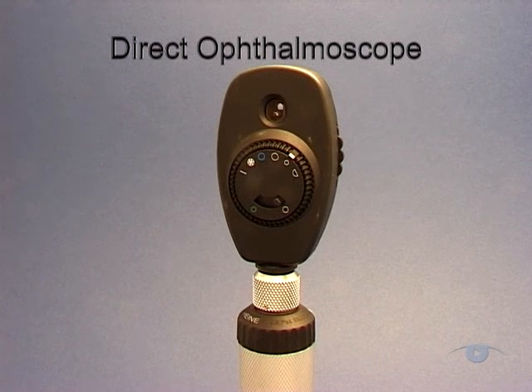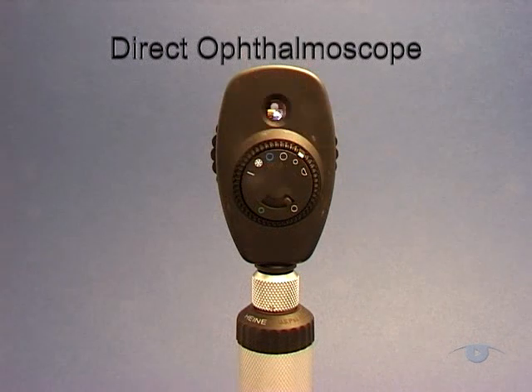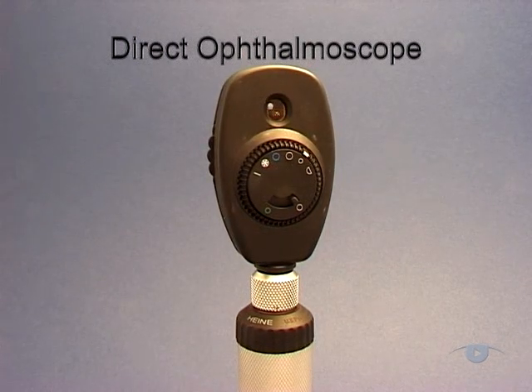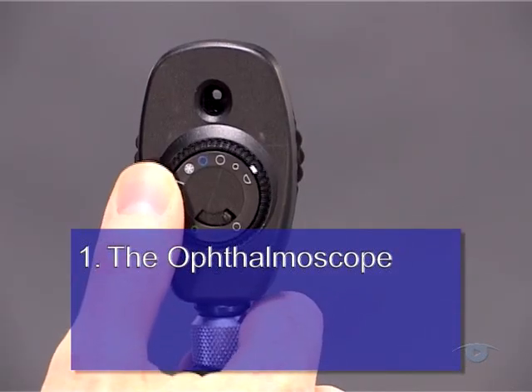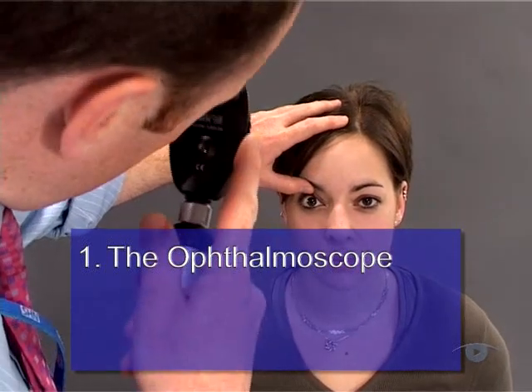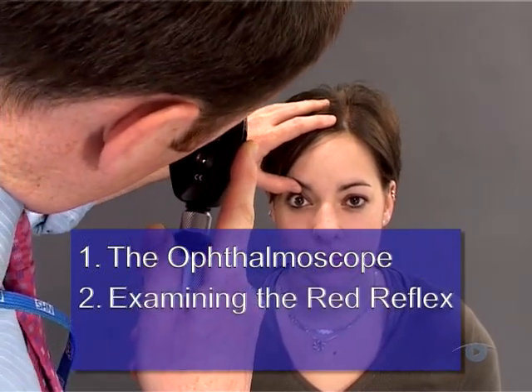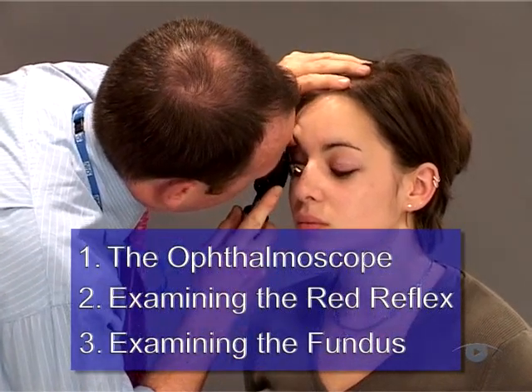The principal aim of this video is to teach you how to perform ophthalmoscopy using the direct ophthalmoscope. We're going to divide up this task into three stages. To start with, we'll show you how the instrument works and explain its controls. Next, we'll take you through how to set it up and align it so that you get a good view of the red reflex. And finally, we'll show you how to systematically examine the back of the eye, or ocular fundus.